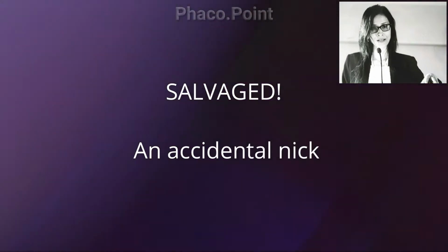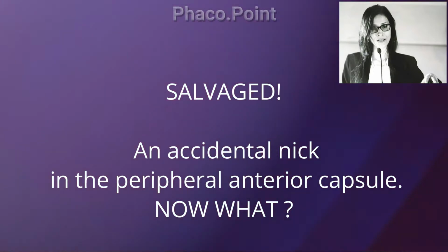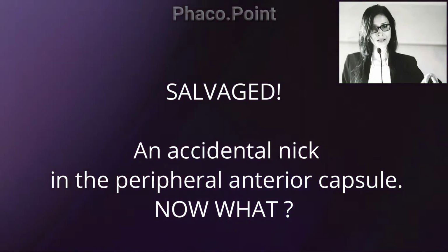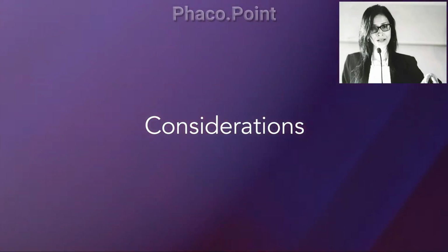In the following video, I'd like to share with you what I would consider are the challenges and the limitations of causing an accidental tear in the anterior capsule and the strategies of how to overcome this challenge. Now here are the important considerations.